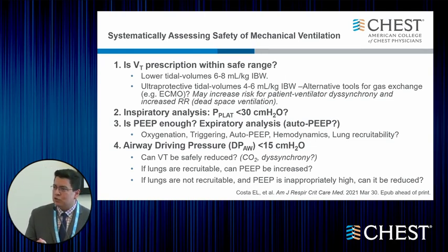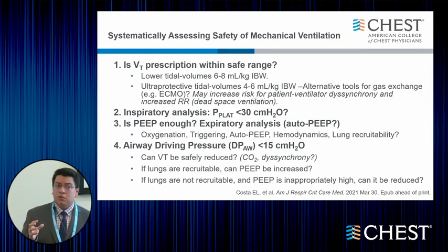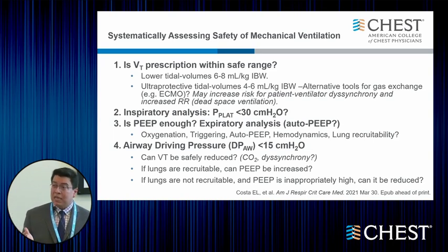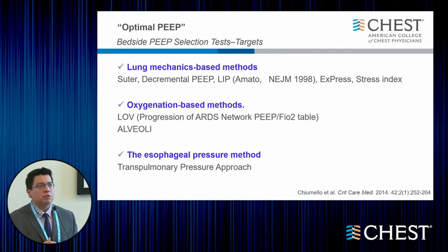And then we pay attention to your airway driving pressure, trying to keep it less than 15, and trying to determine if there is possibility to increase your PEEP if the lung is recruitable and you can actually open up more lung and reduce your plateau pressure, or if you're using inappropriately high levels of PEEP in patients that are very rigid and that will not respond to high PEEP levels. So keeping that algorithm in your mind will help you address some of these questions.